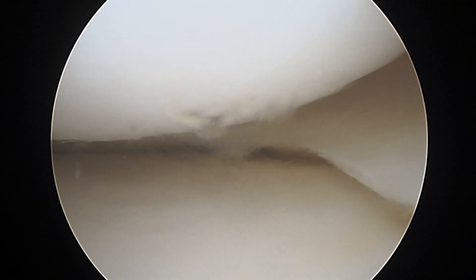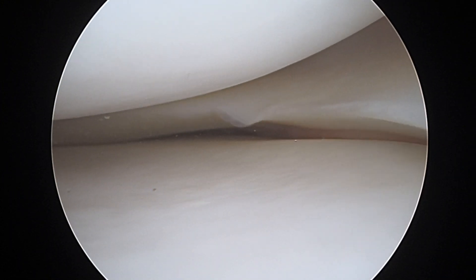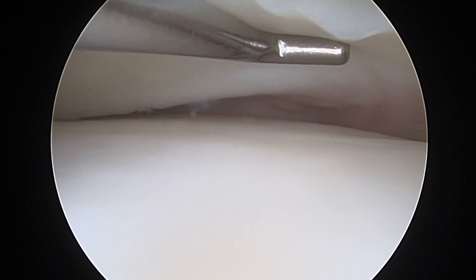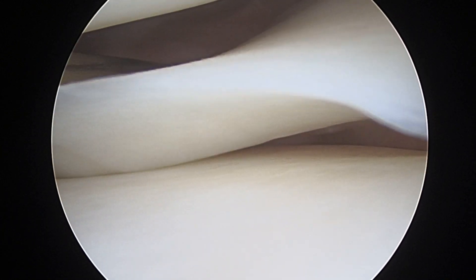There's the medial meniscus. You see a little bit of the synovial fluid — the oily fluid. That's all normal. We'll flush that through. So we'll look at the meniscus underneath. All normal there. Just as the MRI scan told us, you can see the menisco-capsular border where those two come together.